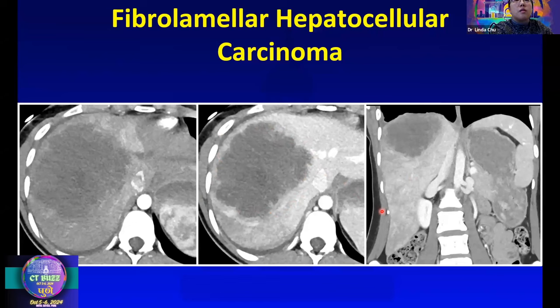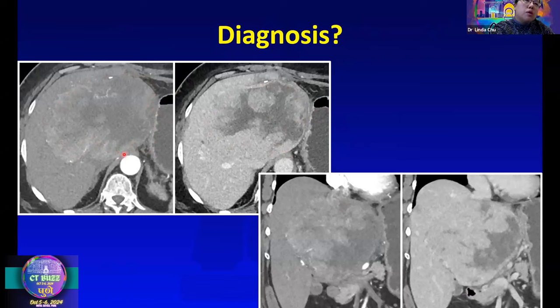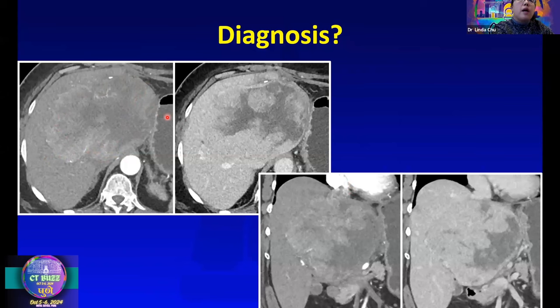From a clinical perspective, that benign-versus-malignant decision is the most important. In this next case, superficially you might think it's a hemangioma because of what appears to be peripheral nodular enhancement with some progressive filling. But when you look more closely on the arterial phase, the nodular enhancement on the periphery is not quite blood pool and looks more heterogeneous. This turns out to be another case of HCC — a wolf in sheep's clothing that could fool you into thinking it's benign. Look at the heterogeneity of the lesion and go down the malignant path.